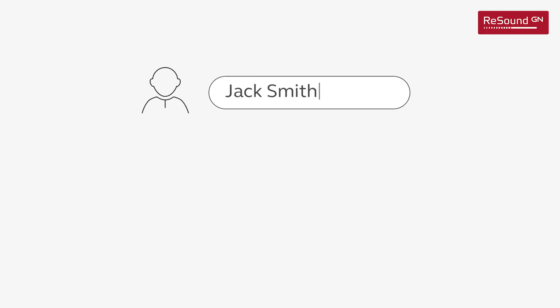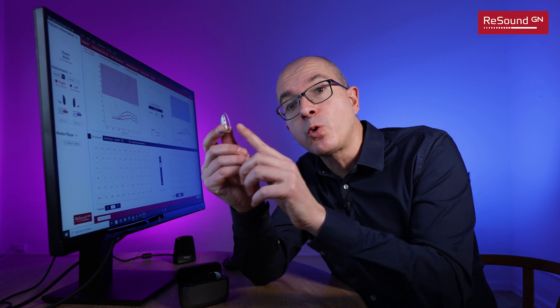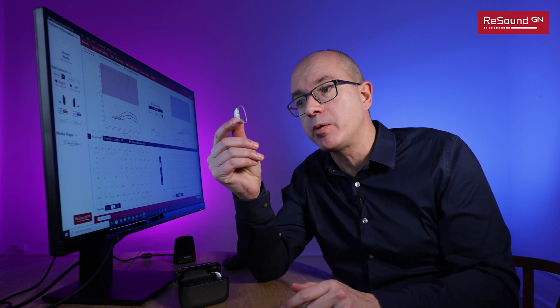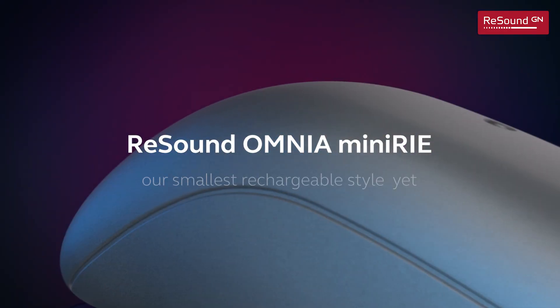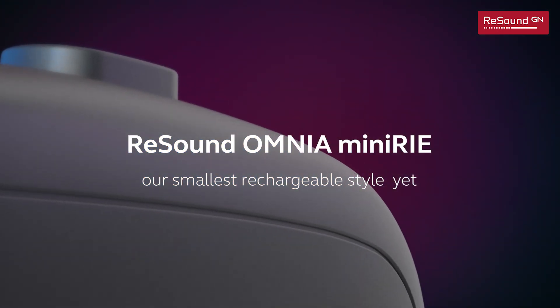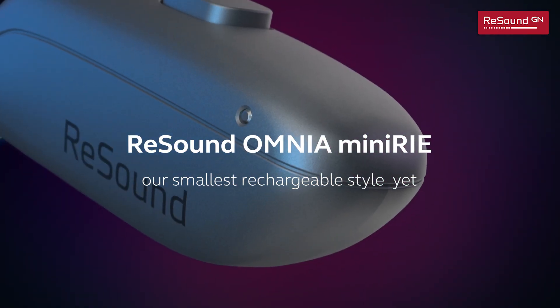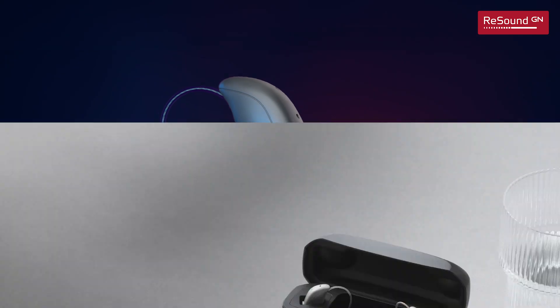We are going to assume that Jack Smith has a mild to moderate hearing loss as you see here, and we are going to fit him with the new ReSound Omnia Mini RE, which is a new receiver-in-the-ear model part of the ReSound Omnia family, and this has become one of my favorite hearing aids.